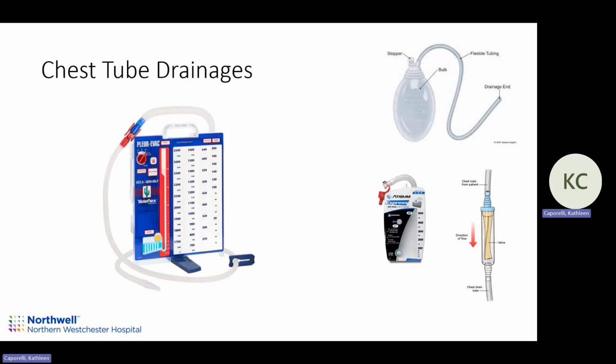Okay, so once the tube comes out of the body, what do you hook it up to? Again, you hook it up to a Pleurovac. If it's a mediastinal drain, I'm not worried about a pneumothorax or air leaking from the lung, so we can sometimes hook it up to a bulb. That's usually for the Blake drains. Sometimes patients are really sick. They've got an air leak and they're sick of being in the hospital. They've got too much output to go home, and they can tolerate being off of suction, but they still have an air leak, and I don't want to take the tube out because it's not safe. We have to find a way to send them home. So there are a few different options, and these are just two of them.